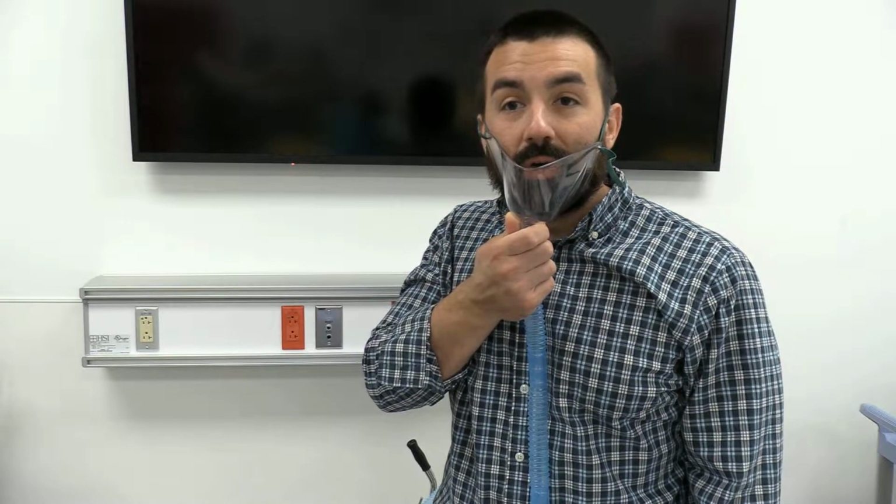I don't know if you can see that kind of aerosol cloud here. The good thing about aerosol, we can tell if somebody's getting enough flow or not if you look really, really closely. As long as the amount of aerosol coming out of the device doesn't completely disappear on inspiration, it'll slow down. But as long as you still see more coming out than what I'm taking in, you know that you're providing high flow for that moment in time.